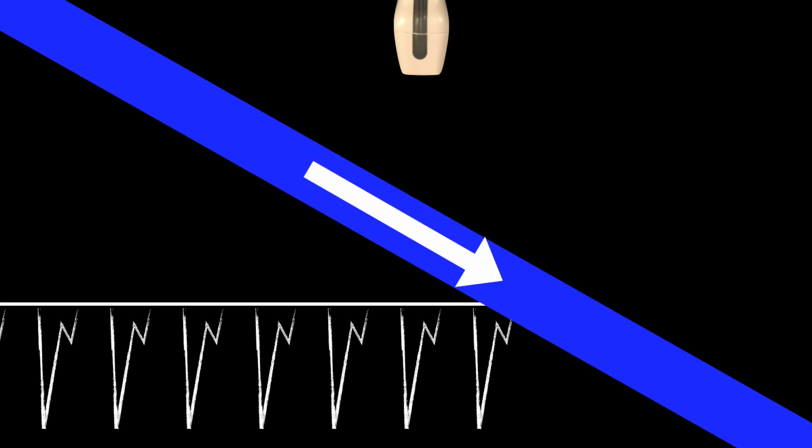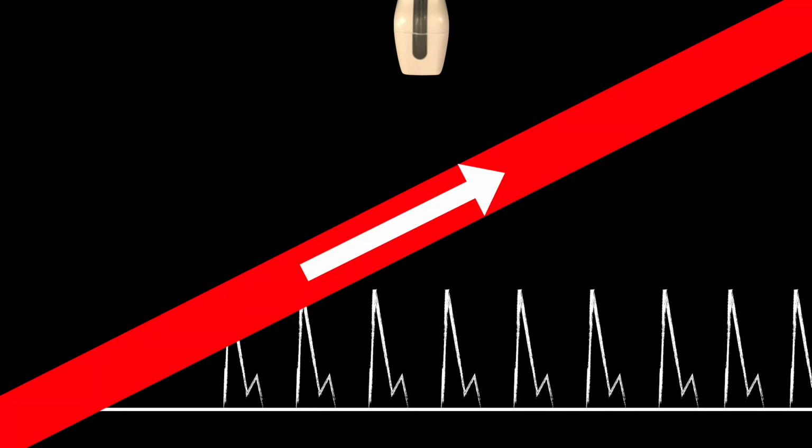The same thing is true if you use pulse wave Doppler. If you use pulse wave Doppler, you may see this type of pattern if you're hitting the artery, but if you aren't hitting it well, you may not see anything, or even a vein may be confusing. So this is an example of what you may see, but you've got to take it with a grain of salt. Here, if you have it coming towards you, it would be red on color Doppler. On pulse wave, you may see spikes if it's arterial. If it's a vein, it would just give you a nice constant flow, and it may look like this.